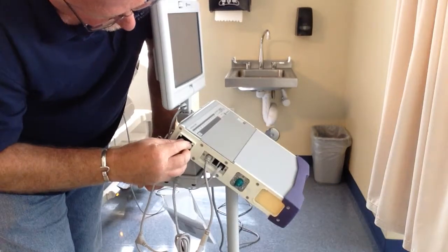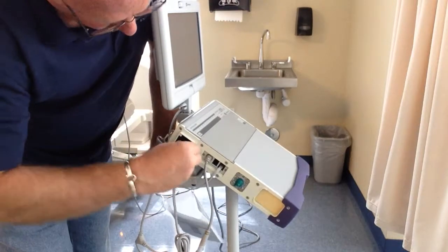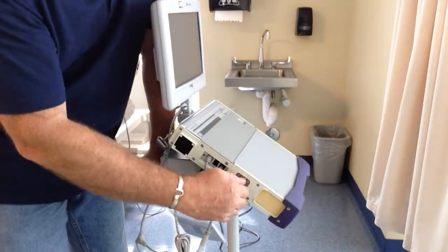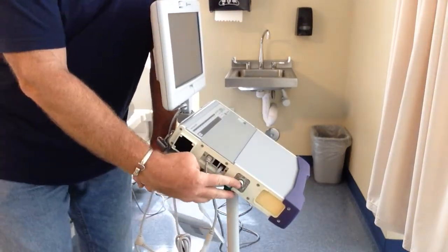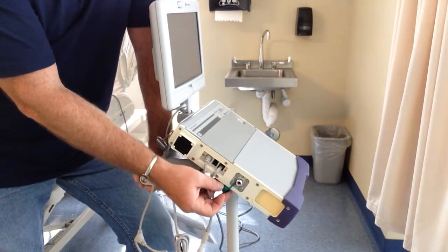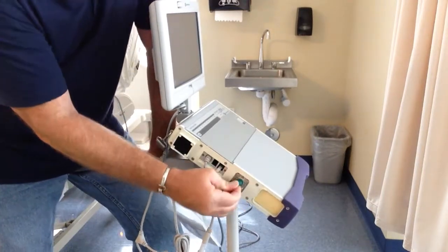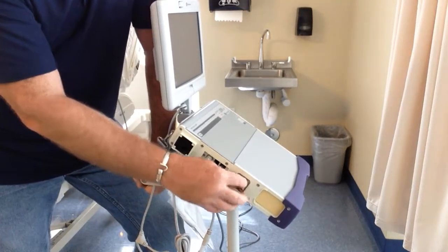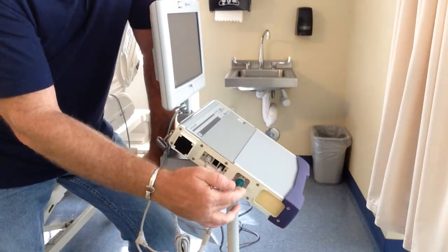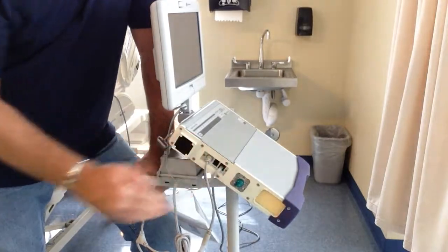I'm showing you how it is — you just use a key or something to pop it out; a small screwdriver and it pops back in. 50 psi O2 inlet: you can hook it up to 50 psi to use the blender. If this is on home care use, you hook it up — you put a nipple on here, a green Christmas tree or something.